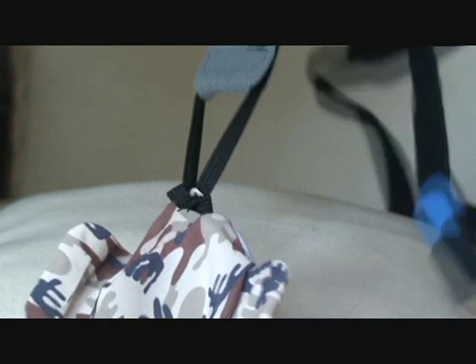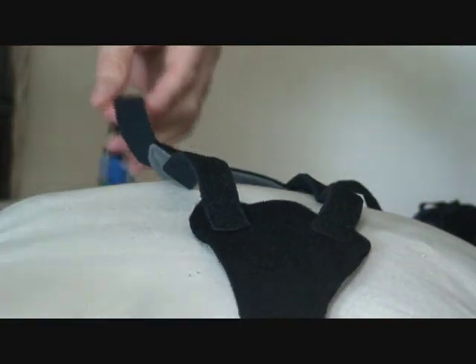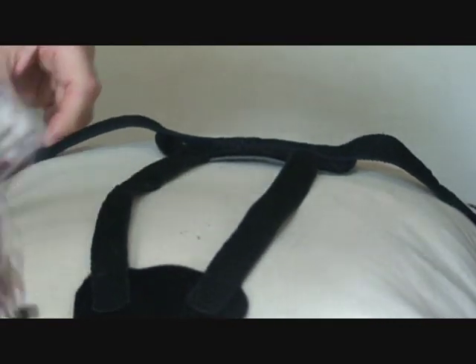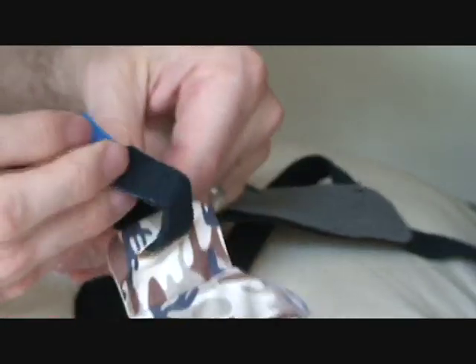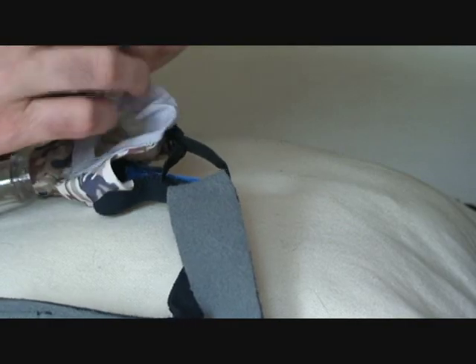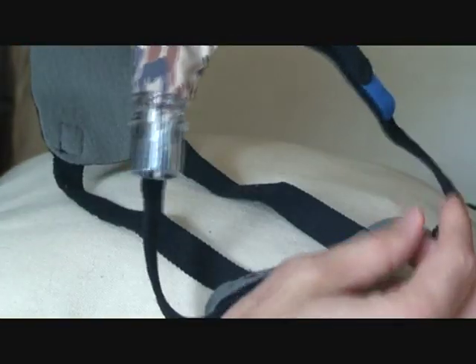Okay, then you're going to pull it a little tight so you can see what happens there. So now you just want to make sure that everything is laid flat. That way you don't have it twisted. So all the straps are flat on this pillow. You can kind of see how it's arranged. So then thread it through the outside, and you're good. Alright, all done. New headgear is on. Would that take us about, I don't know, a minute?